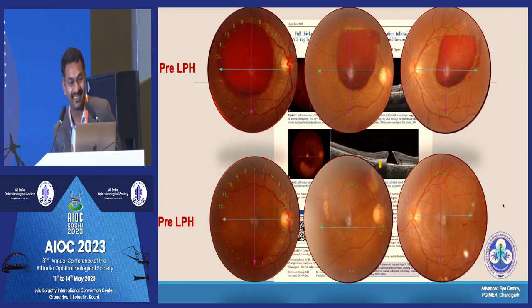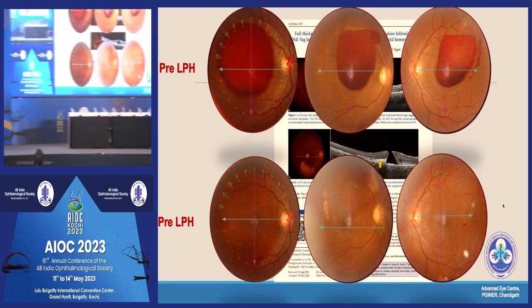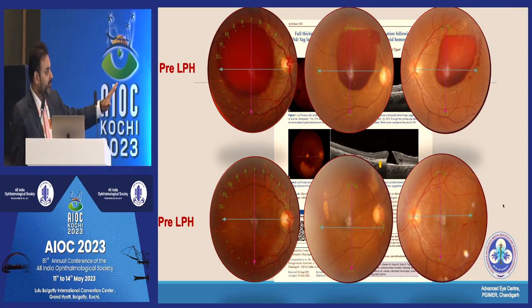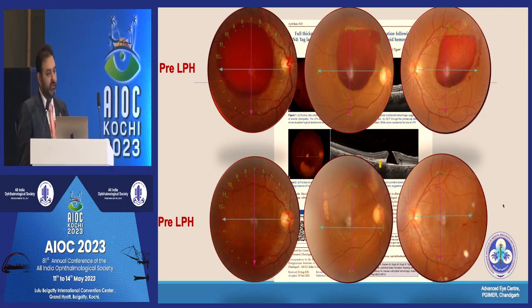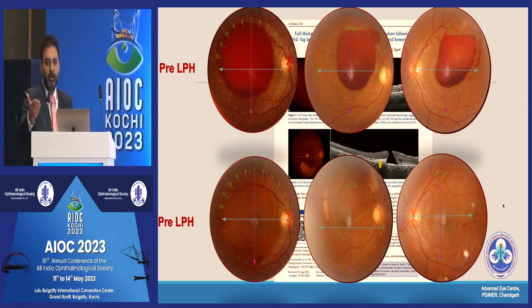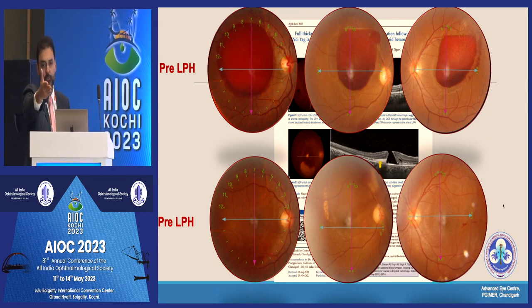Thank you, Basav. I'm going to first start the discussion with the second of your cases, which is the YAG hyaloidotomy for premacular bleeds in patients who might not be able to undergo surgery, are not willing for surgery, or for whatever reason it might be. Just going to throw it out to Samyak. I'm going to pose this to you.